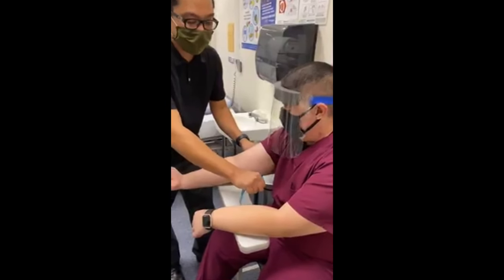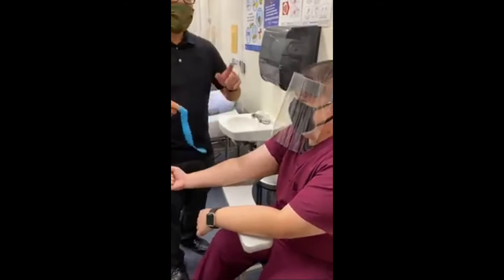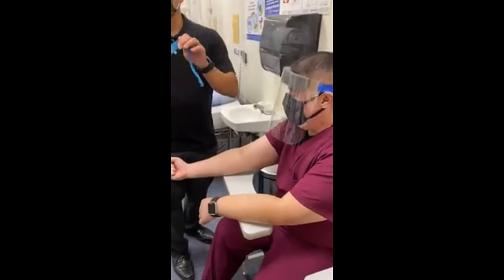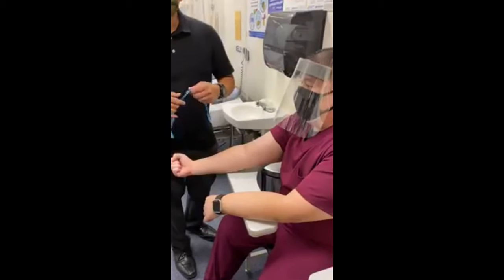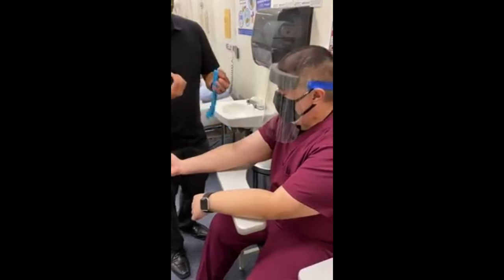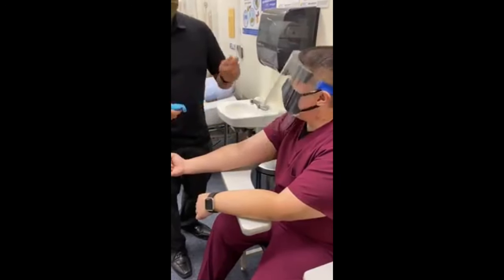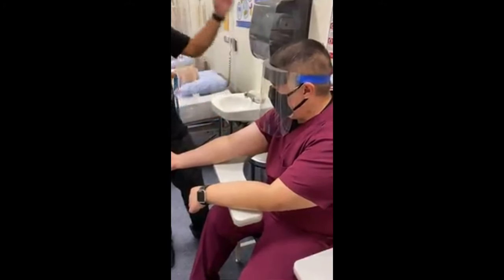You're not wearing gloves. Oh no, for a tourniquet, you don't have to wear gloves. When you're putting the tourniquet on, no. But when you touch any body part, you can, as long as when you do hand sanitization, that's before you stick the patient. In this case, when it came in, I hand sanitized already.